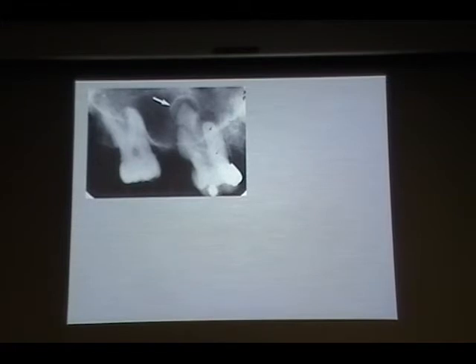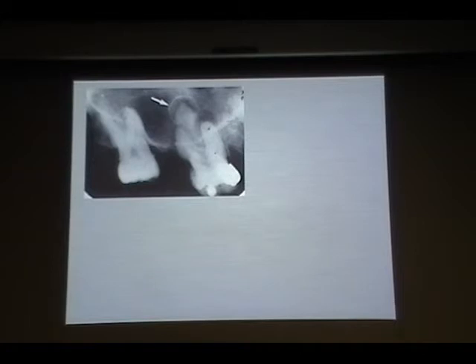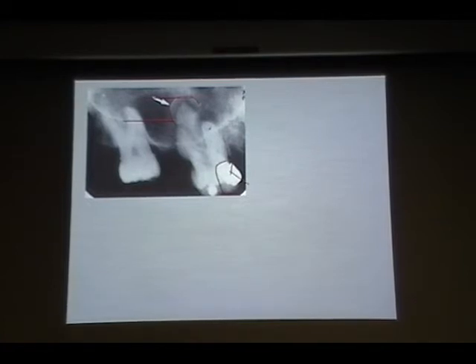Here, I'm stretching a little more to explain that if you see a tooth with dental caries, like here, and there is a restoration or a filling, you can see a white line, right? That white line is nothing but the exudate that has come from the pulp or from the tooth into the apical region, and the lamina dura has pushed like this. That white line presentation tells you that it is related to a tooth problem. It's not a maxillary sinus problem.